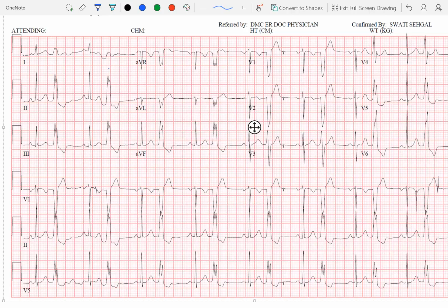So in summary, we have a patient here that has an EKG showing a ventricular bigeminy, most likely from the right ventricular outflow tract. Of concern for the emergency department physician is to be able to determine whether or not the patient has a structurally normal heart. If they've had previous echocardiograms available for review, you can generally feel a little bit better sending the patient home with outpatient cardiology follow-up if they have a structurally normal heart and no symptoms related to this arrhythmia. Yeah, absence of symptoms, absence of syncope, structurally normal heart. Yeah, those sort of things.